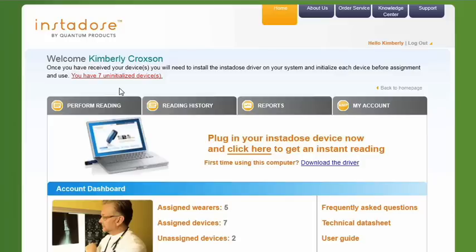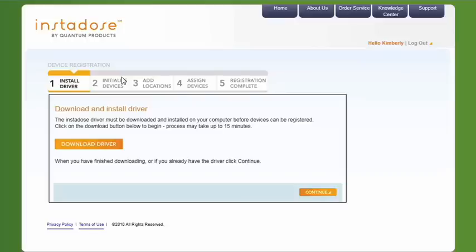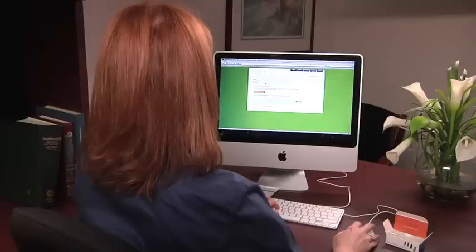Click on You Have Uninitialized Devices. This will launch the Device Registration Wizard, which will guide you through the registration and initialization process. First, download the driver onto your system. The driver contains our proprietary algorithm that calculates the dose stored on the dosimeter.